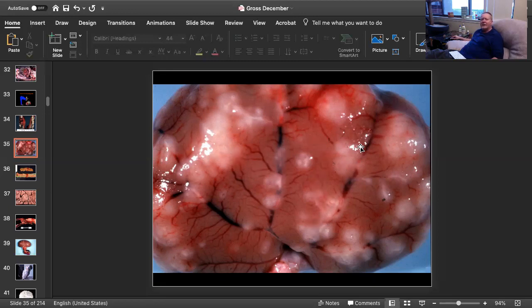My morphologic diagnosis would be pyogranulomatous. I'll take lymphoplasmacytic, lymphohistiocytic. I'll take any of those because no two cases of FIP look alike under the scope. Well, I'll say pyogranulomatous renal vasculitis with nephritis. And that's key to have both parts. This is really a vasculitis.